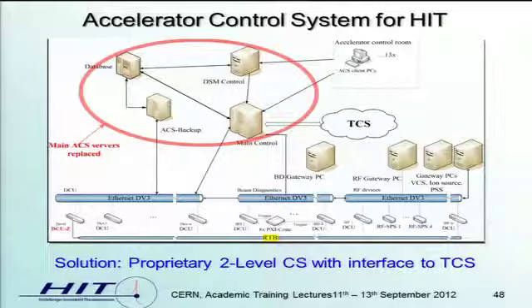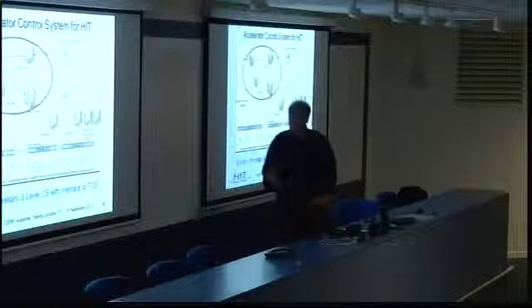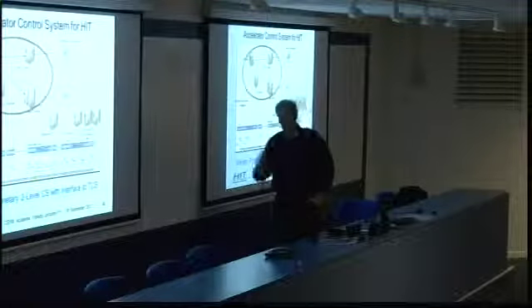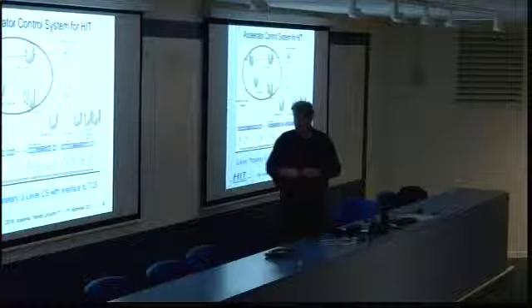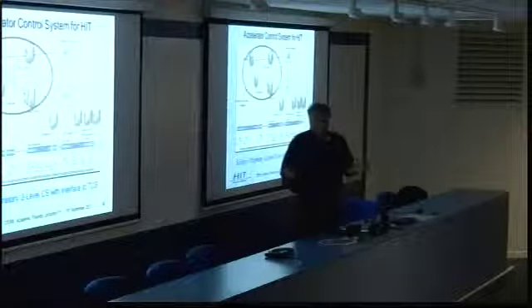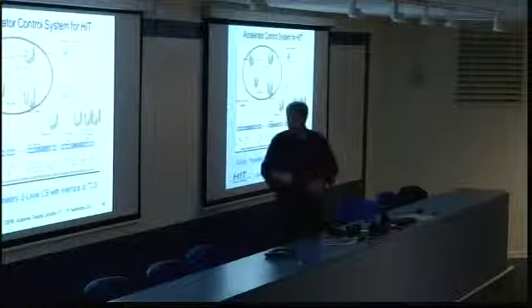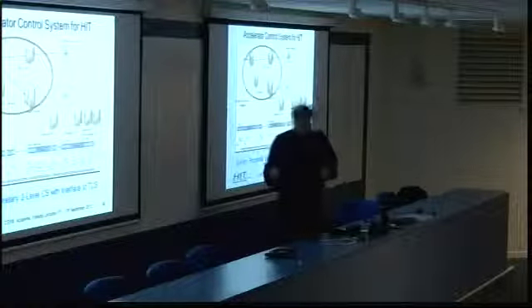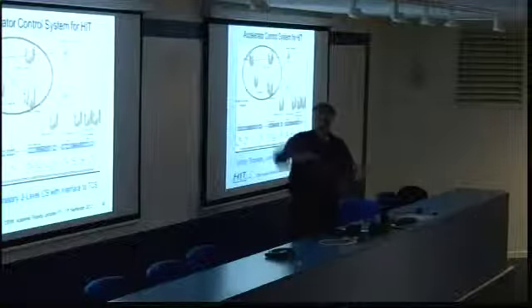We have really developed a so-called DCU, an embedded controller. So for any power supply, we have such a controller with a large memory for all these different settings. In the case of the ramp magnets, we have only 255 energies times the ions, but then you have a lot of ramp data.